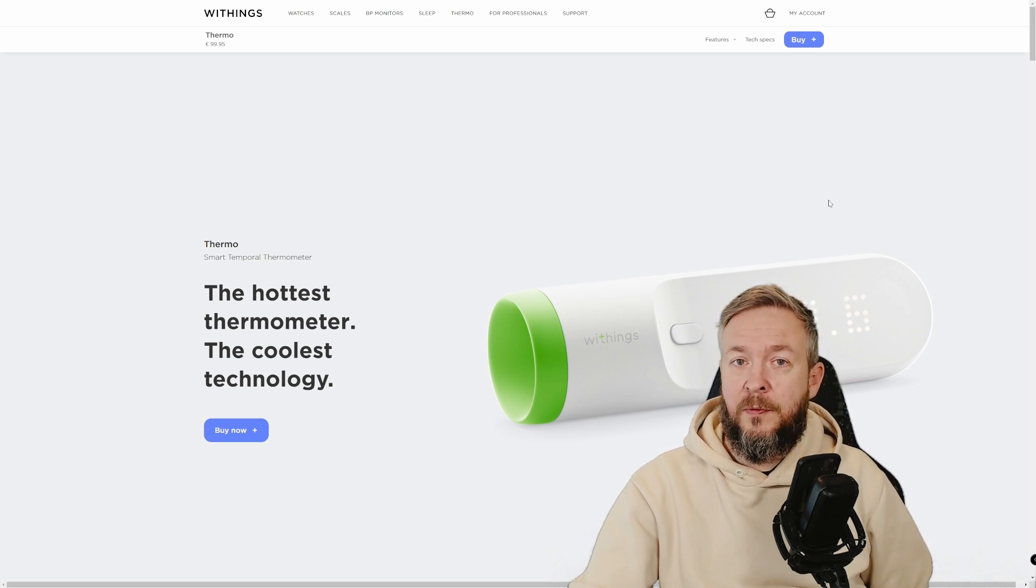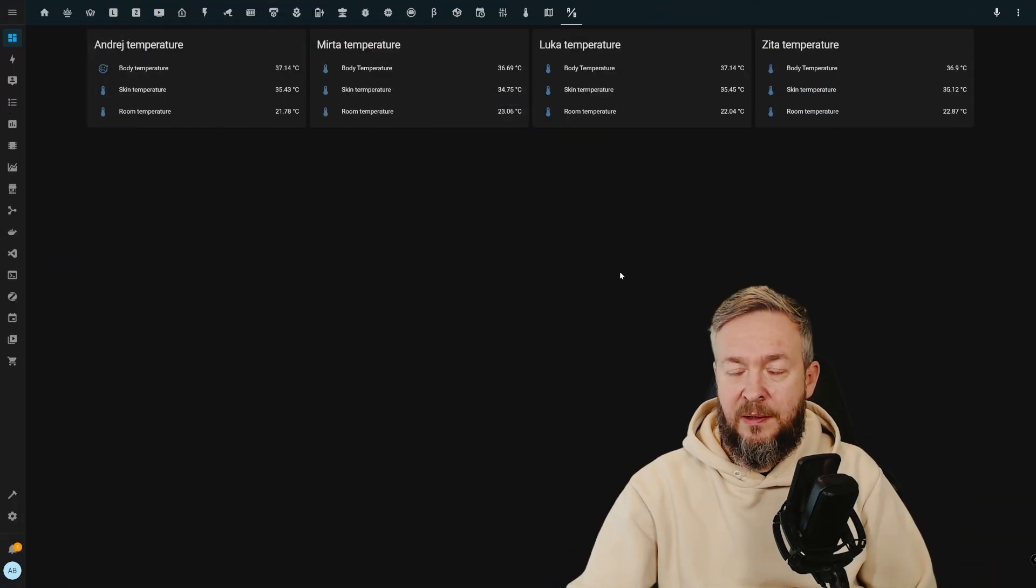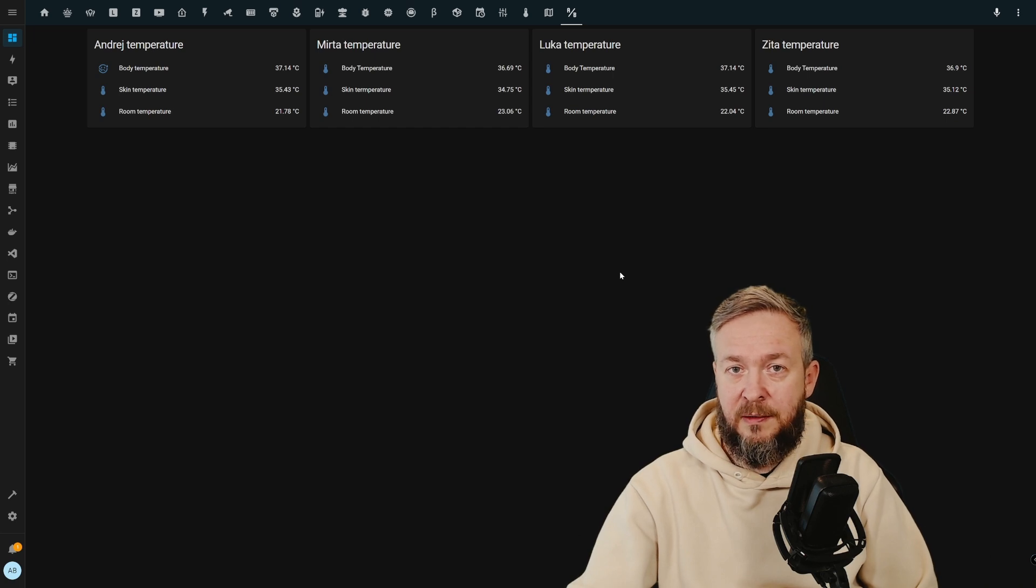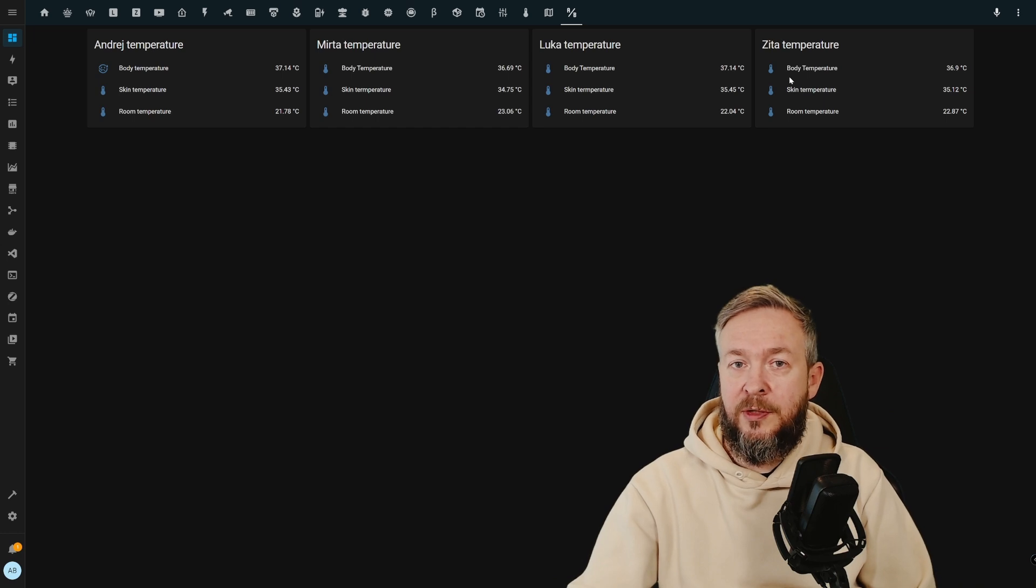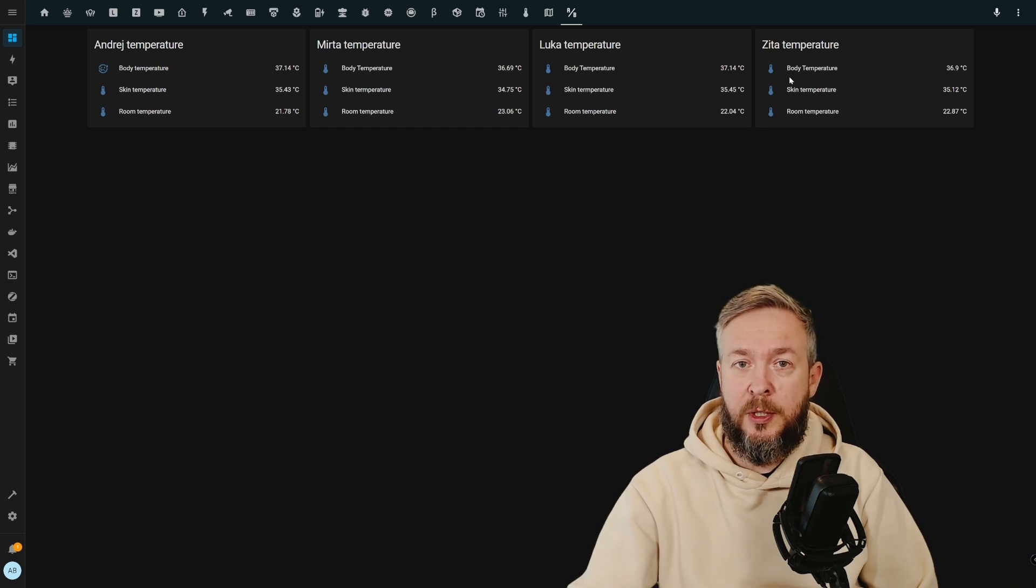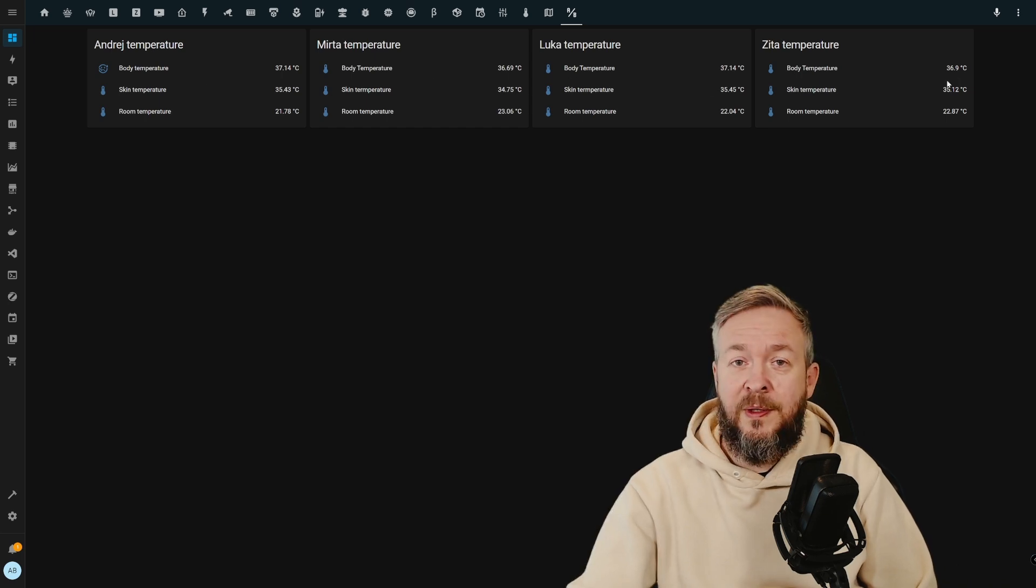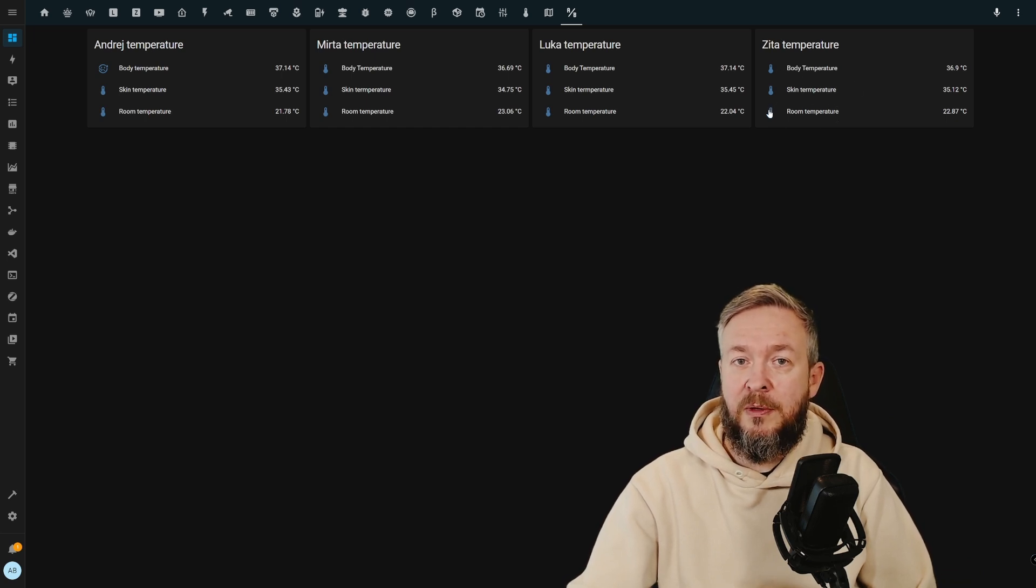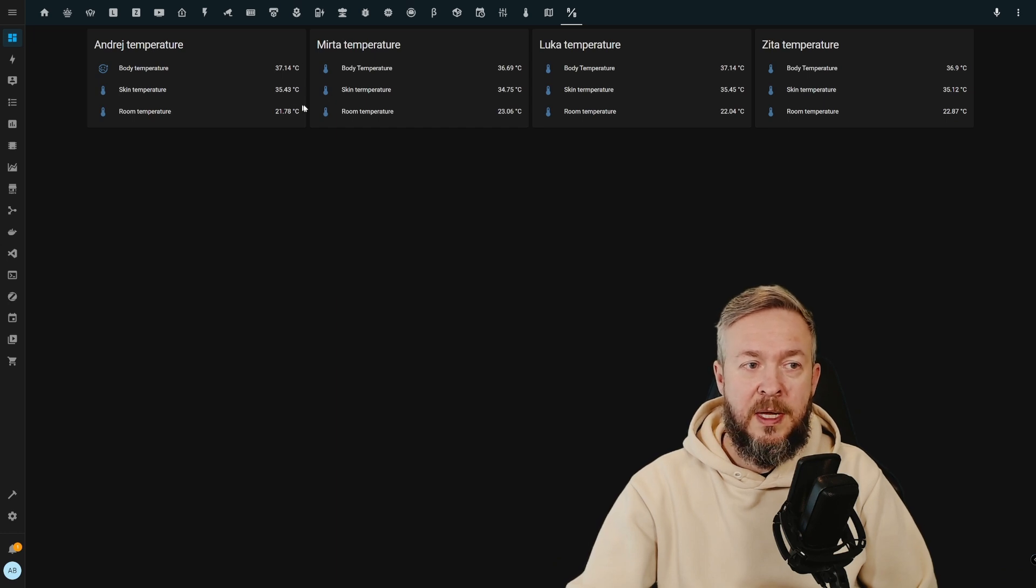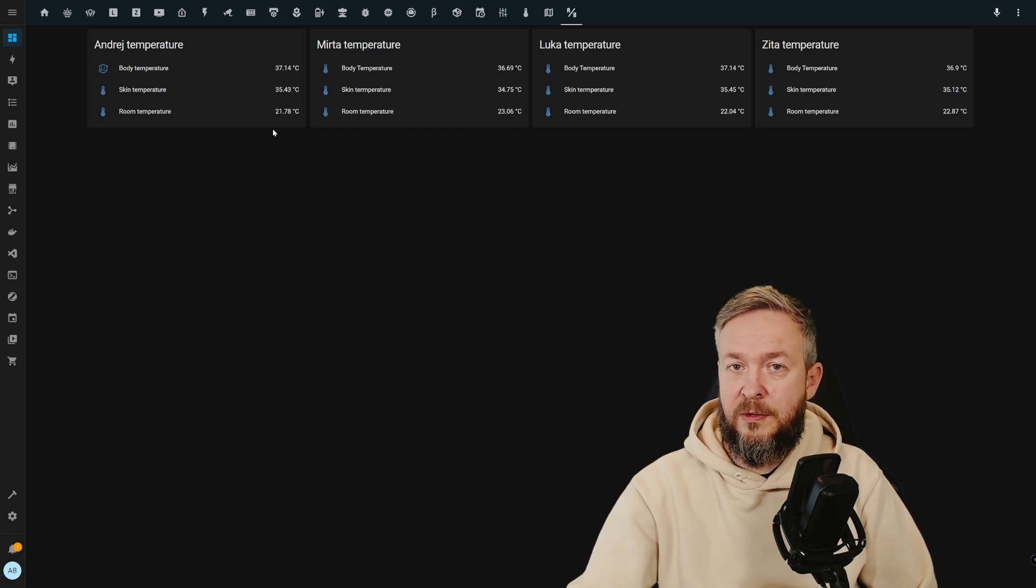What will you get from the Withings integration inside Home Assistant? For my main setup, I have Withings integration enabled with four profiles. Each profile is tied to a family member, allowing me to independently track measurements for temperature, or if you have a scale, independently track scale information. One thing I didn't know that the thermometer gives you is three readings for each temperature taken: body temperature, skin temperature, and room or ambient temperature when the temperature was taken. For example, my temperature was 37.14 degrees Celsius, my skin temperature was 35.43, and room temperature was 21.78 degrees.